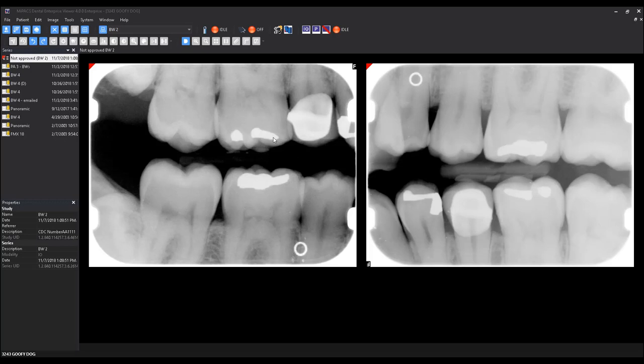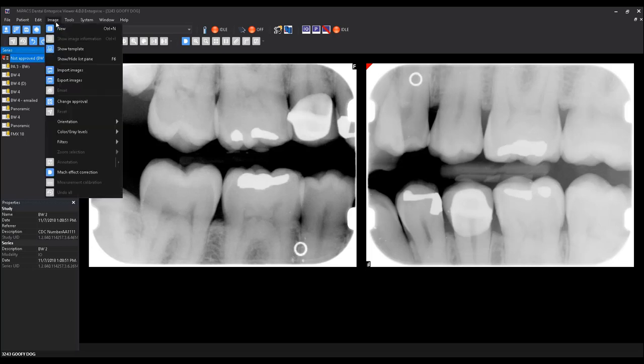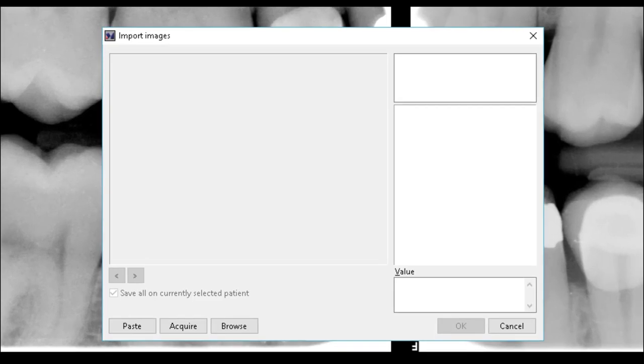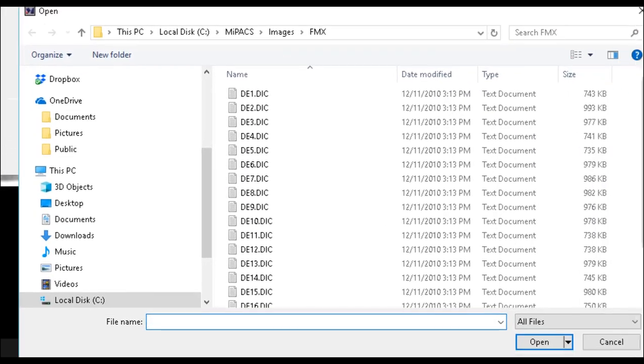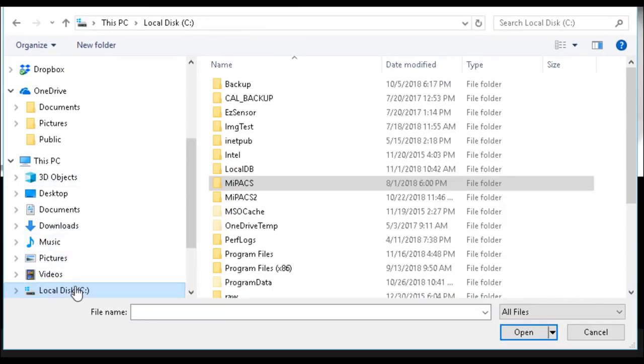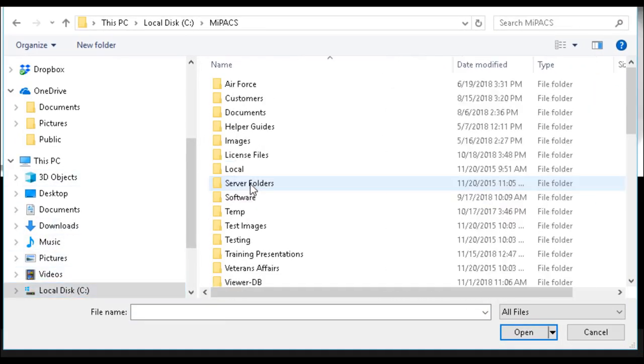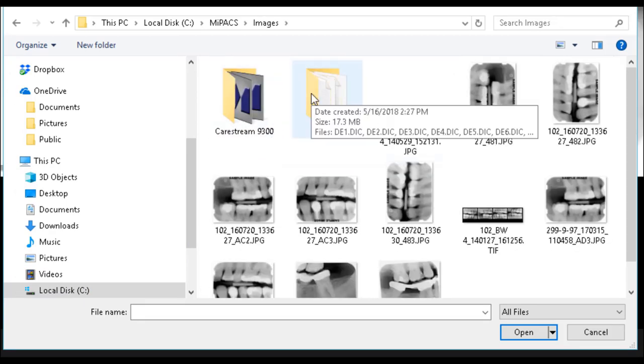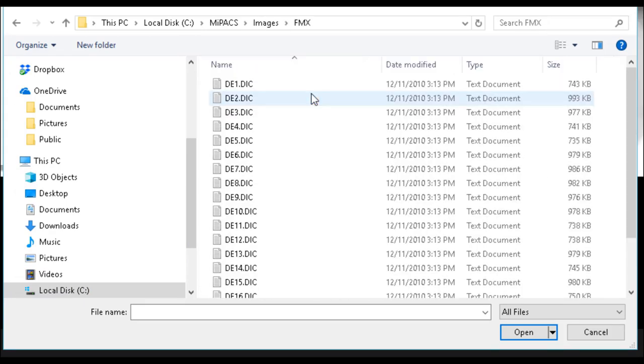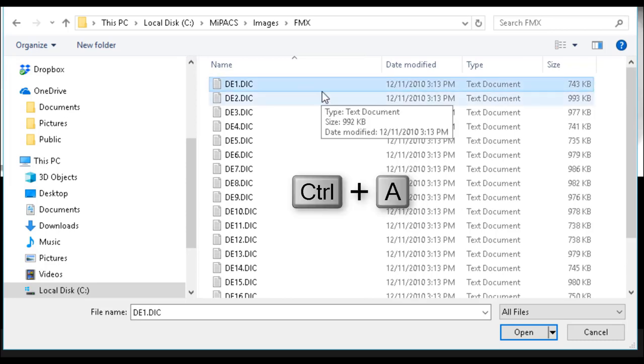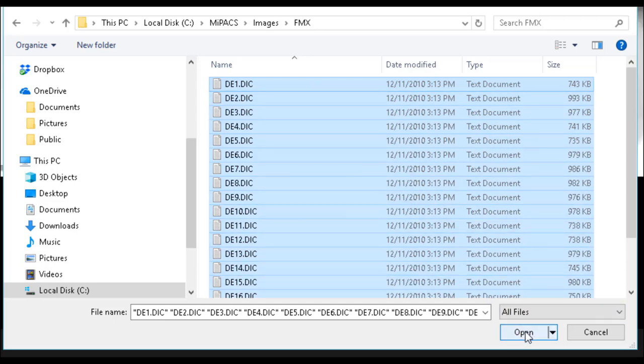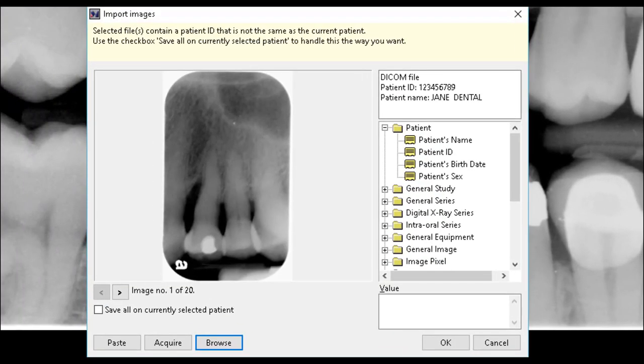Once the patient record is open, select Image, Import Images. Then select Browse to select the DICOM files. You can use Control A to select all files in the folder. After all DICOM files have been selected, select Open to proceed.